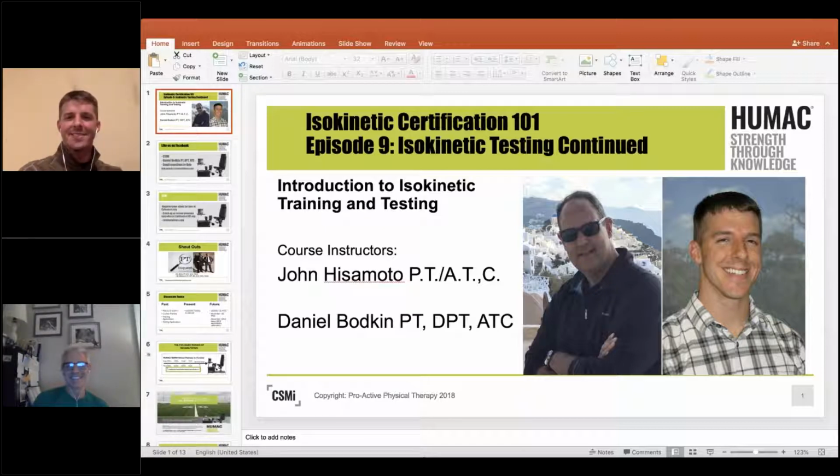So thank you guys. Again, a phenomenal effort by Daniel. Last month we went over the science background behind the interrupted stroke, some of the concepts that we wanted to do, and kind of talked about the start to finish. Tonight, what Daniel's going to do is really show you how to perform an interrupted stroke test. In my mind, this is probably one of the most important webinars that we're going to be hosting this entire year. And credit goes to Daniel for all the effort and work that he's put in these last few weeks to get this up and running. So Daniel, when you're ready, it's all yours.